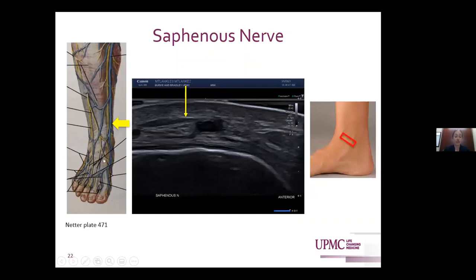The saphenous nerve, which is the terminal branch of the femoral nerve, is at this point a purely sensory nerve. It's more commonly evaluated at the knee, but you can see it at the ankle. One way to find it is to look at the great saphenous vein, avoiding excess transducer pressure. You may find it more quickly if the patient has saphenous neuritis at the ankle, as they may be more tender or have a Tinel's sign.